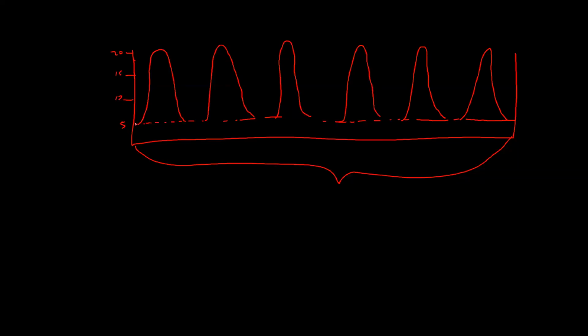So if I take this dot right here, and I count that as far as my pressures go, that's 5. And the dot next to it's at 5. And this dot right here is 6. And this dot right here is 10. You see where I'm going with this? And this dot here is 20. I'm going to add all of those pressures all the way through there, and then I'm going to divide them by how many dots we had, and it's going to give me the average pressure for that entire minute.